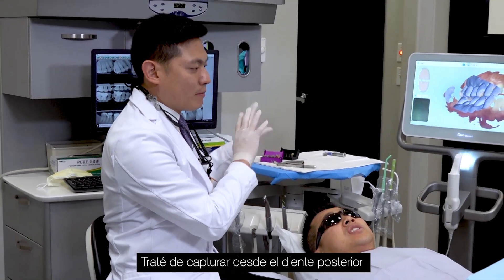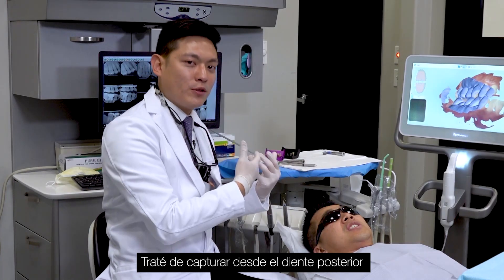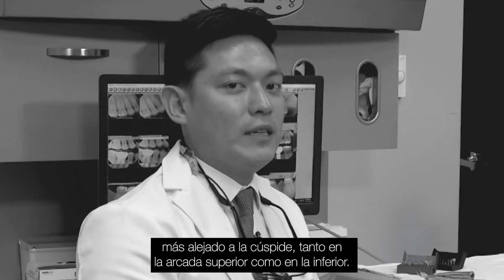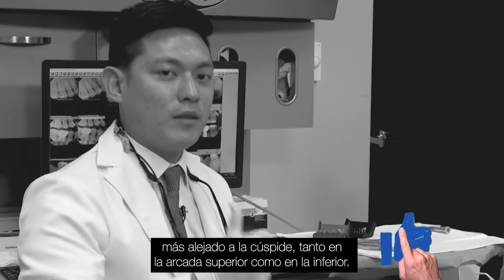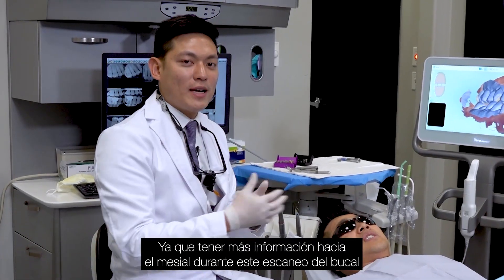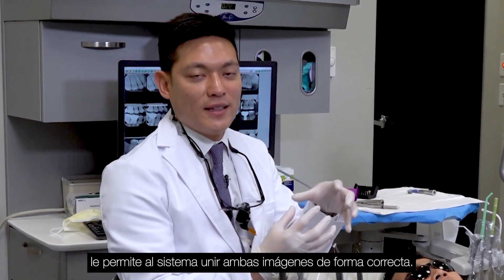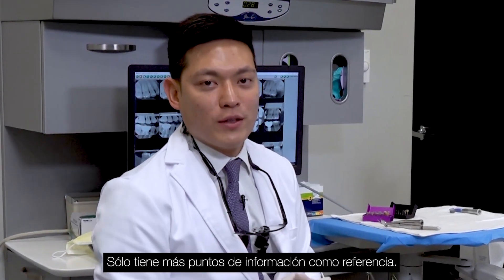Because we scan from the posterior — we try to capture from the most posterior tooth to the cuspid on both the upper and lower — even if the restorative prep is the most posterior last tooth, by having more data toward the mesial during this buccal scan it will allow the system to accurately bring those together, as it just has more data points to reference.